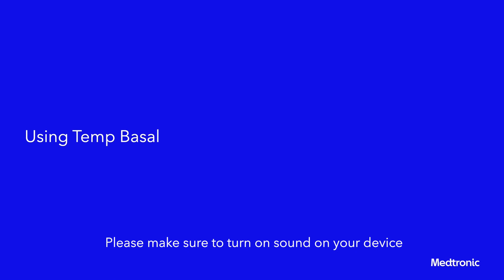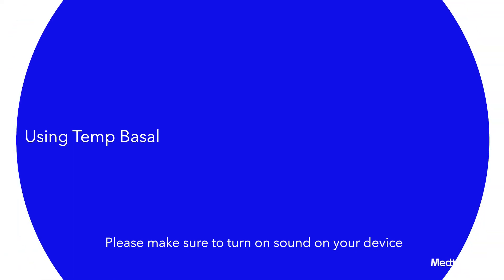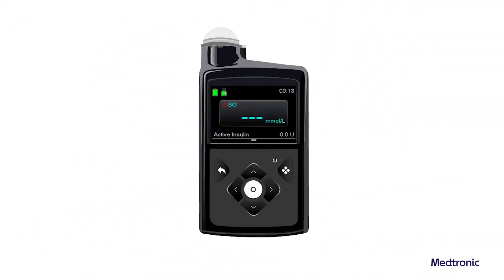Using temp basal. The temp basal feature helps set and start a temporary basal rate that can be used immediately to manage blood glucose for short-term activities or conditions. The duration of the temp basal rate can range from 30 minutes to 24 hours.